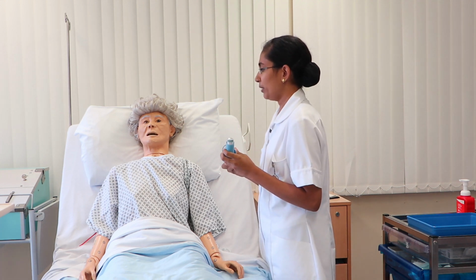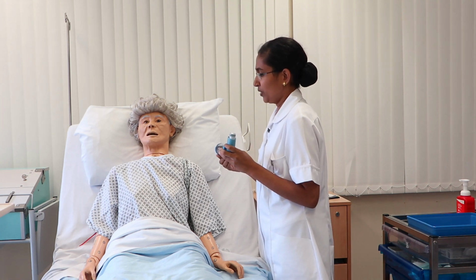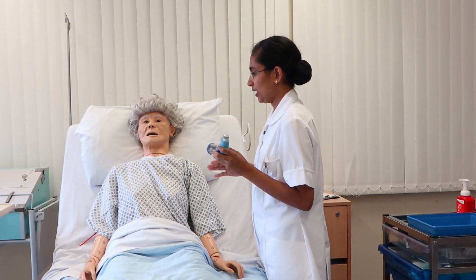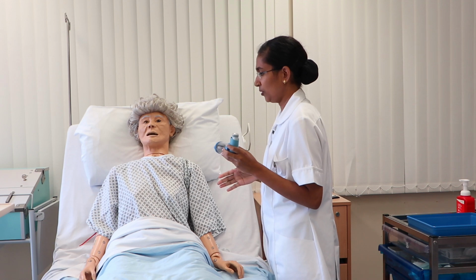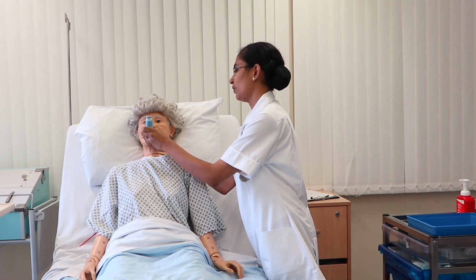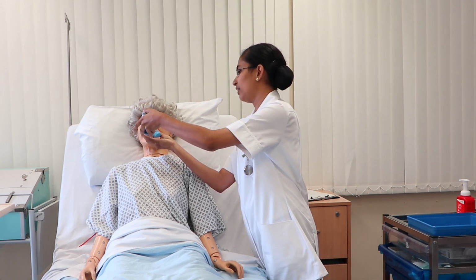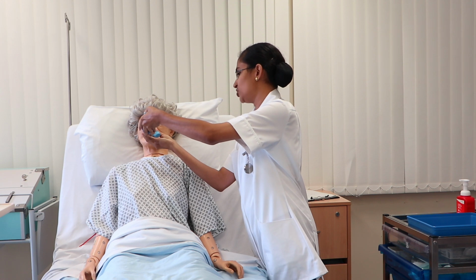Okay, Bob, can we have the first set of respiration? Okay, inhale, exhale, inhale, exhale. Seal it with your mouth to the mouthpiece. Okay, and can you just tilt your head backward? I am going to press the canister.